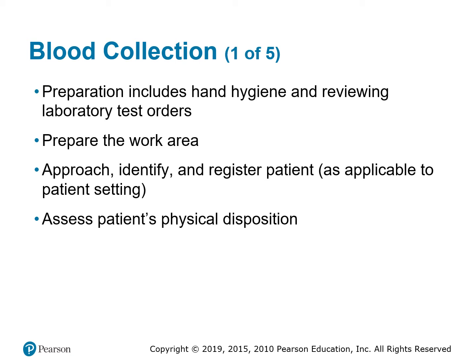We have to sound confident in knowing that we know what we're doing as a phlebotomist collecting a venipuncture. We have to make the patient feel comfortable enough for us to invade their personal space, because we are in their space. We are pretty much in their personal perimeter space. So we have to introduce ourselves.